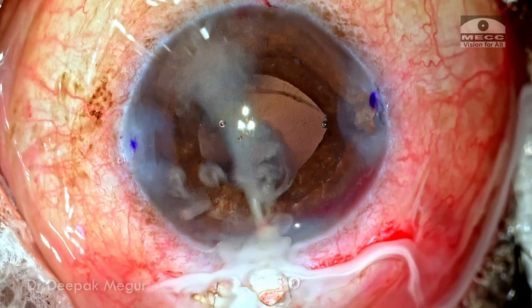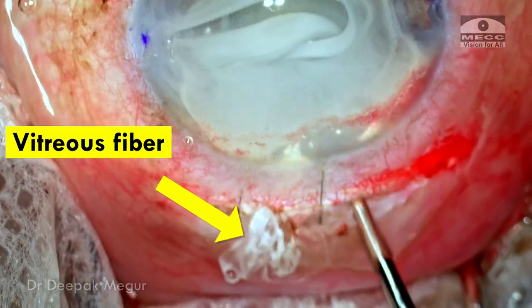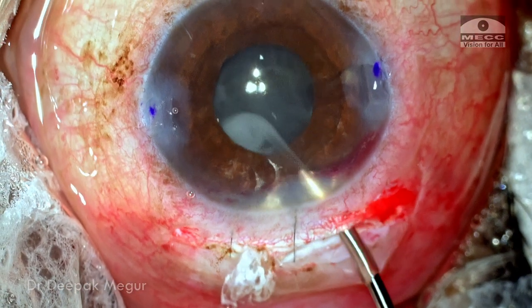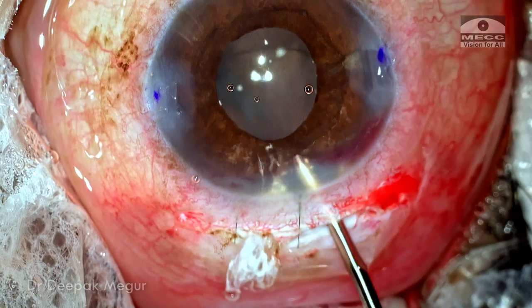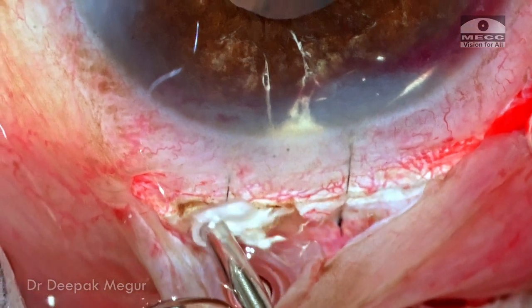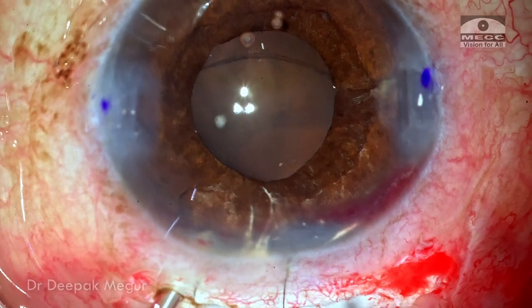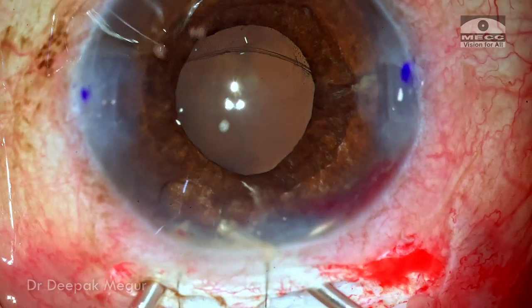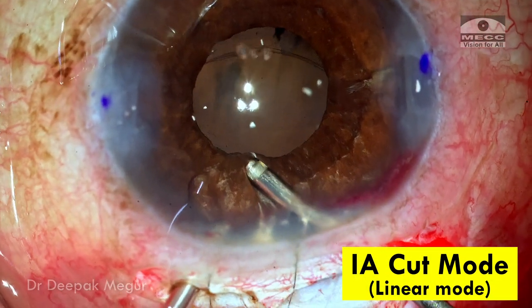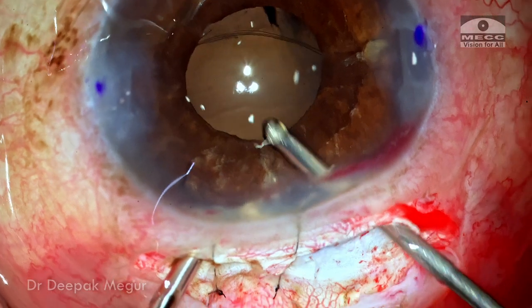Before placing the lens, I want to reconfirm the absence of any vitreous in the wound. I'm surprised to see a blob of vitreous fiber running through the wound — although the vitreous in the anterior chamber is cleared, there is still vitreous in the wound itself. I'm using the cutter to deal with this vitreous in the wound. I change the vitrector to IA cut mode with linear cutting so I have excellent control over what I'm holding and cutting.